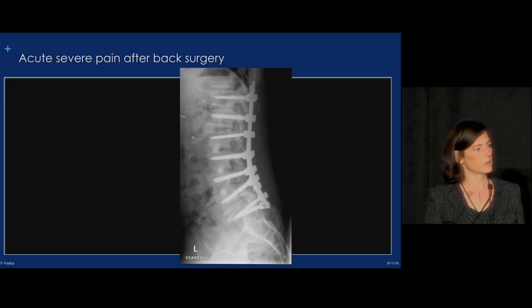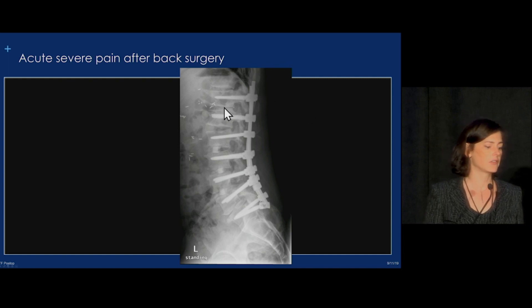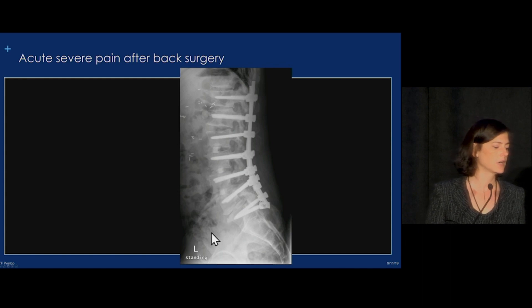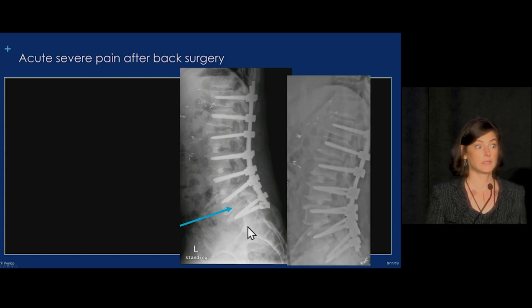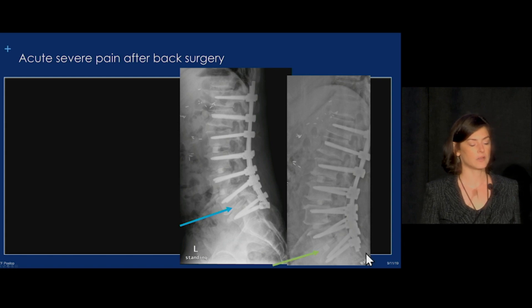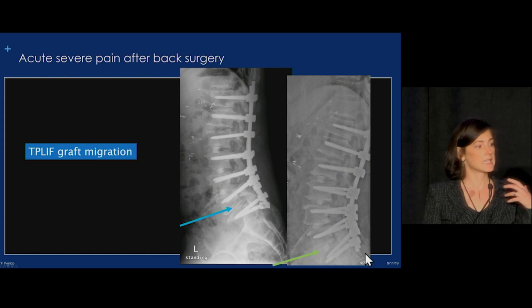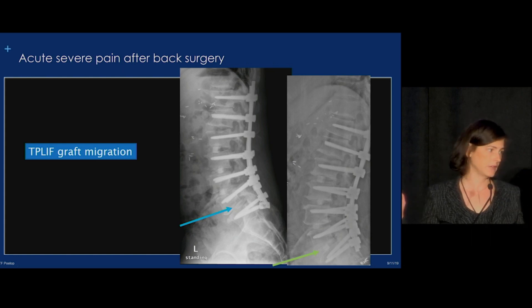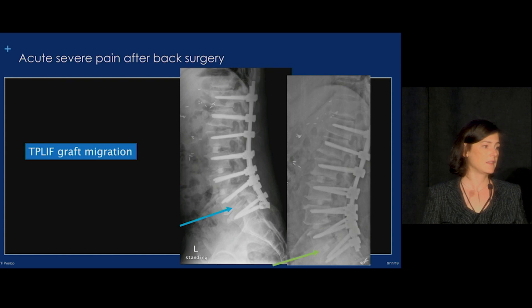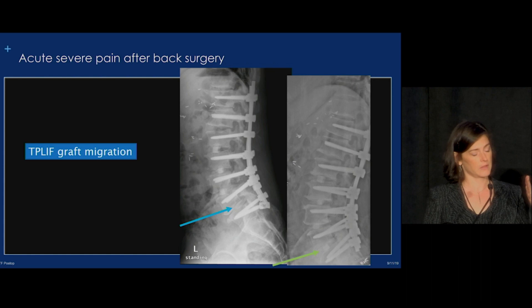Let's briefly talk about some spinal emergencies. This patient presented with acute back pain after surgery. Examining all the hardware carefully, we can see interbody grafts at multiple levels. One interbody graft appears out of position. Comparing to the first postoperative study confirms this is graft migration — it was in expected position immediately after surgery. The key with spine surgery patients is to go back to the first postoperative radiograph and compare, because complications can develop over time and be difficult to find if you're only comparing to the one-month prior study.